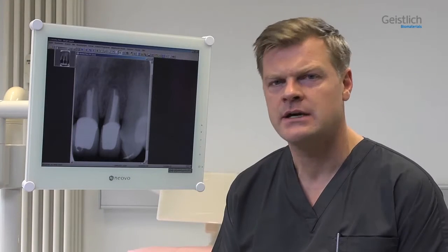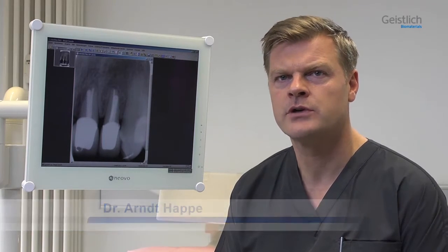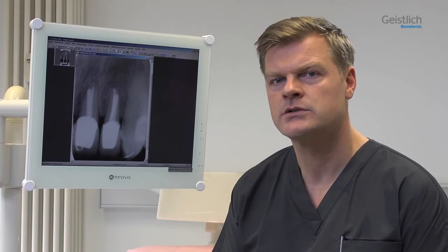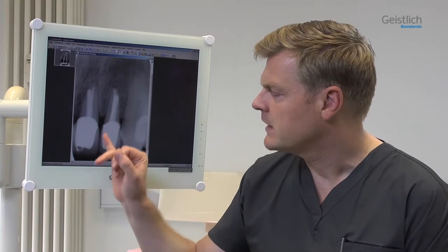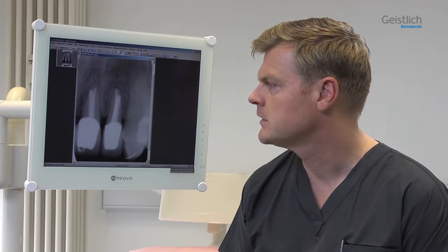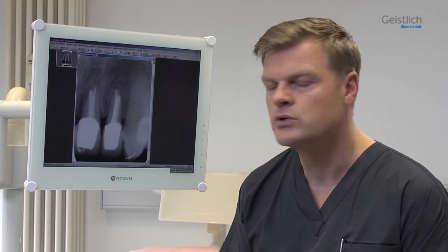This case involves a 48-year-old woman with an unremarkable medical history. The anterior maxilla has been reconstructed with all-ceramic bridges and single crowns about two years ago. As part of this reconstruction, teeth 2-1 and 2-2 were endodontically treated and received relatively large posts. Since then, a longitudinal fracture of tooth 2-2 has occurred, and a few weeks ago a buccal fistula was detected. The relevant area is explored with a periodontal probe all the way to the apex, and there seems to be no remaining buccal bone.